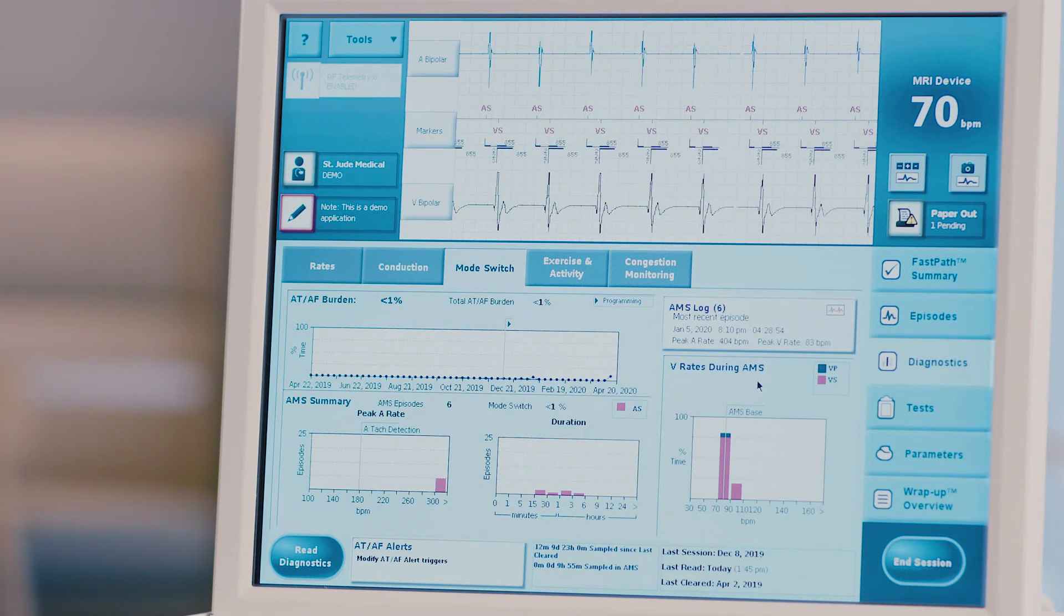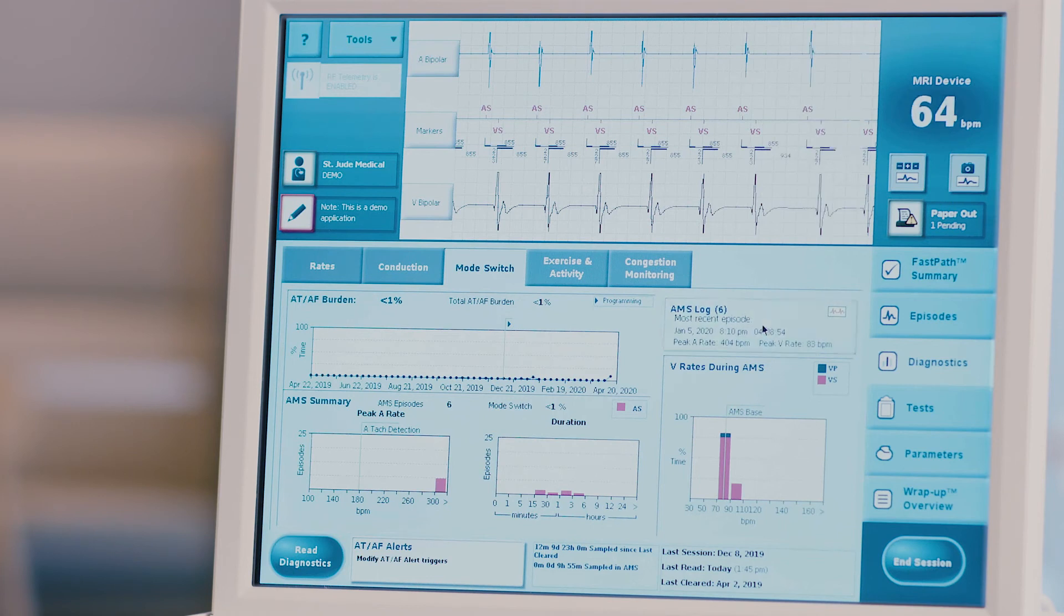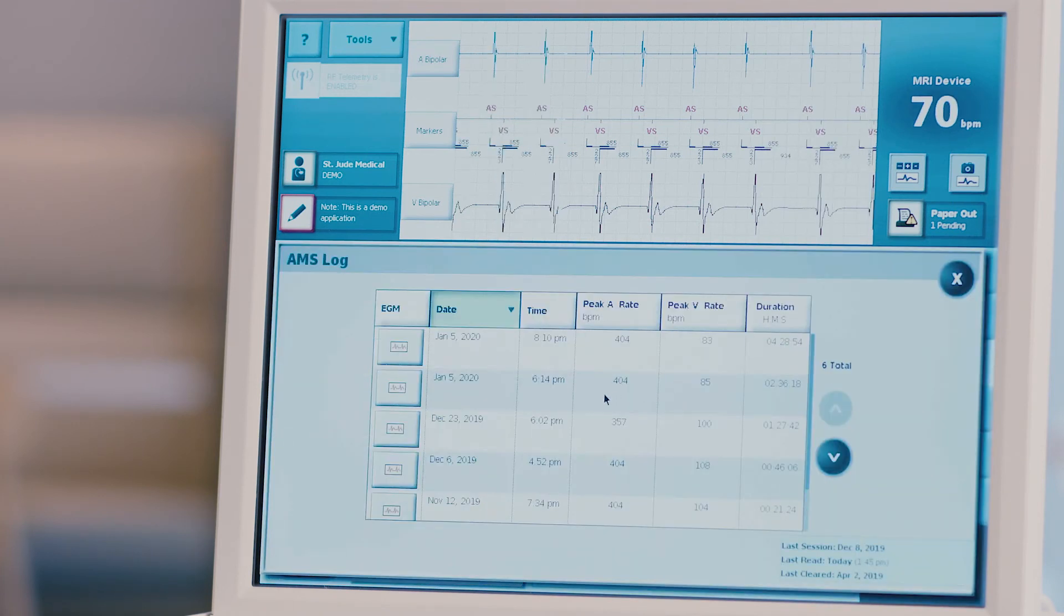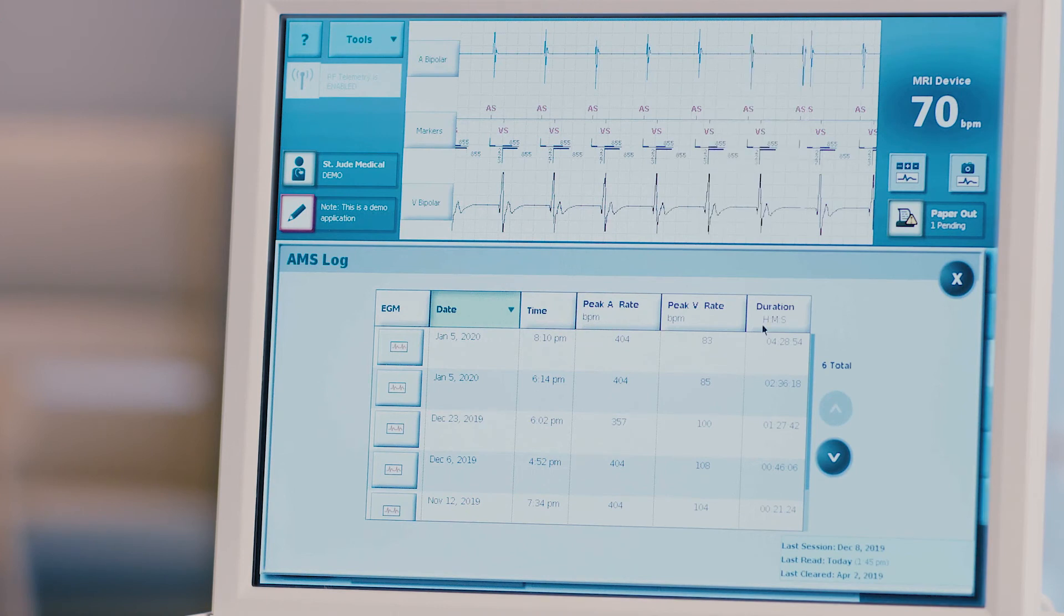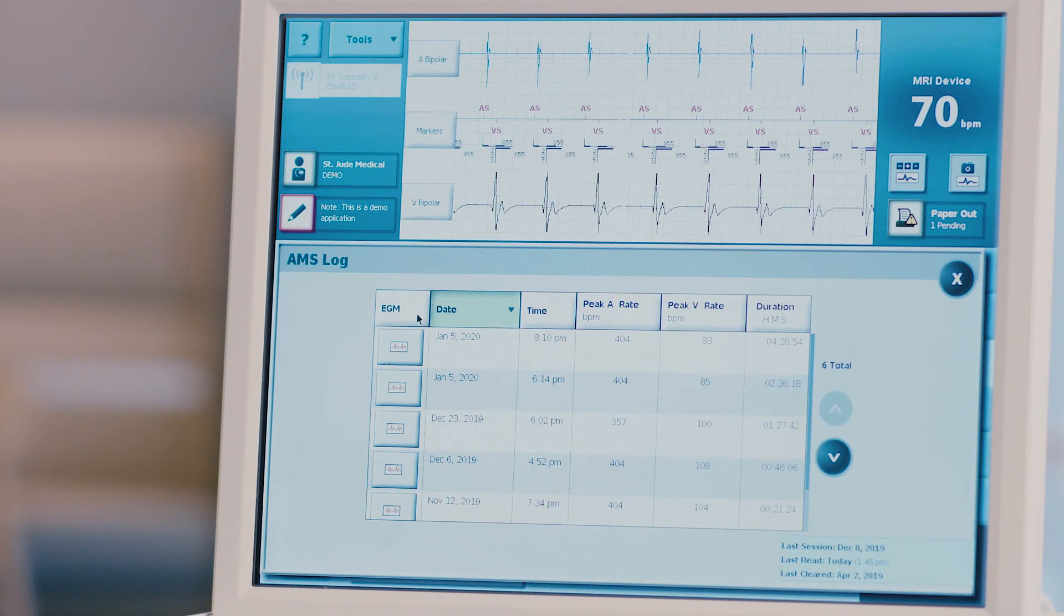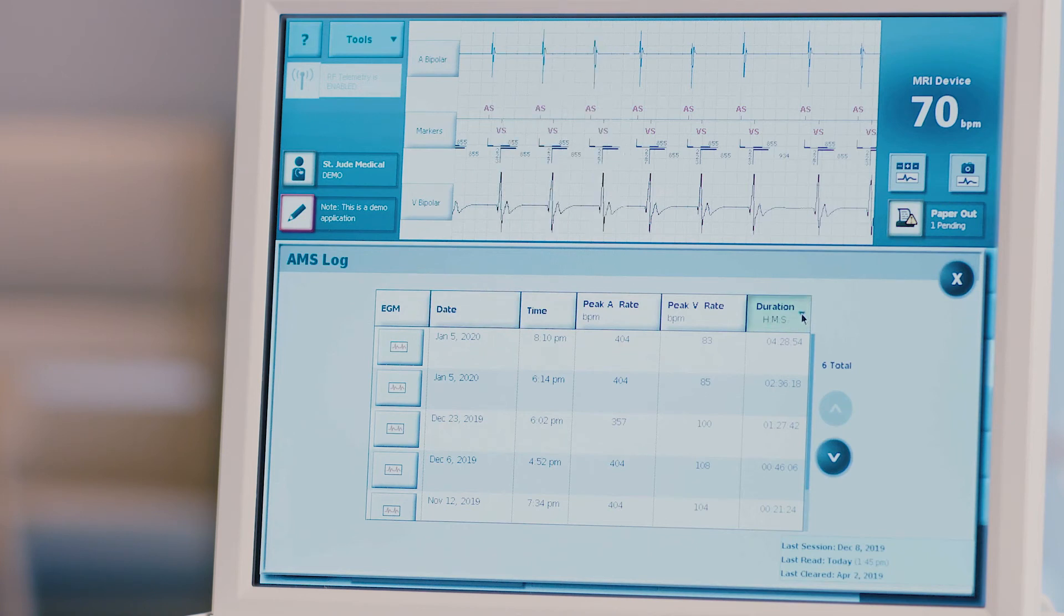The AMS log will list all mode switch episodes stored in the device. The log contains five columns: date, time, peak rate, duration, and EGM availability. To change the sort order of any of these columns, select the button at the top of the desired column. Sorting by duration is recommended to allow easy determination of the longest and shortest episode.